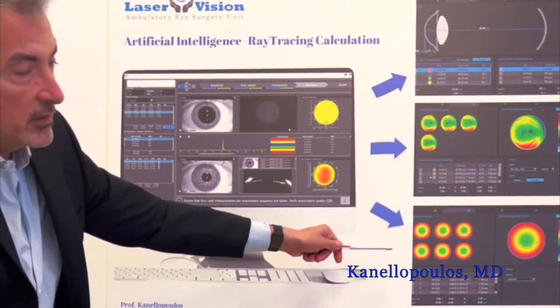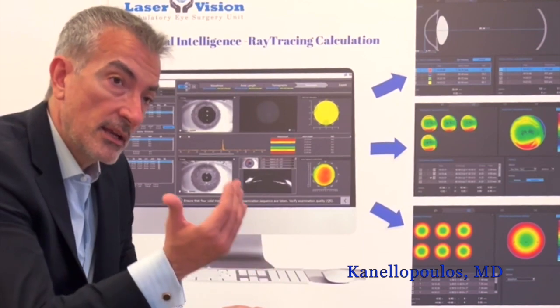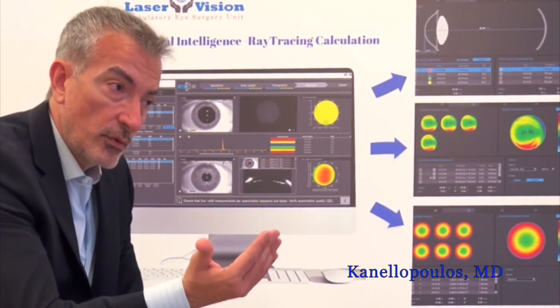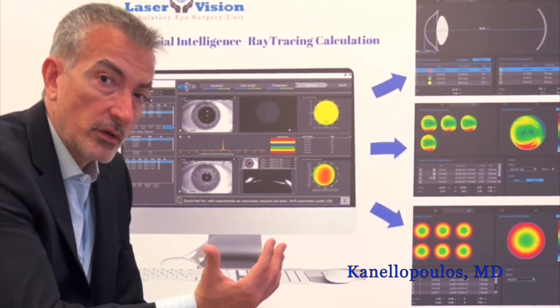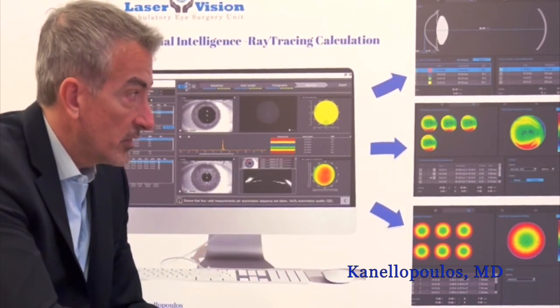Following, the wavefront data are used to study 2,000 rays again in a retrospective fashion from the surface of the retina through the vitreous cavity, going through the posterior part of the crystalline lens, through the crystalline lens, and to the anterior surface of the lens.